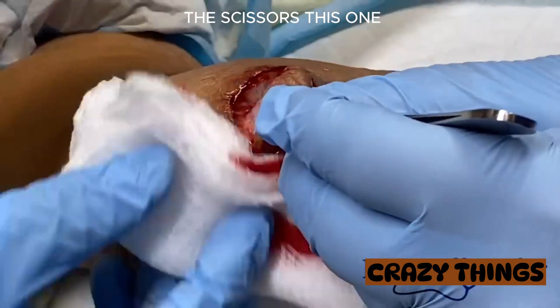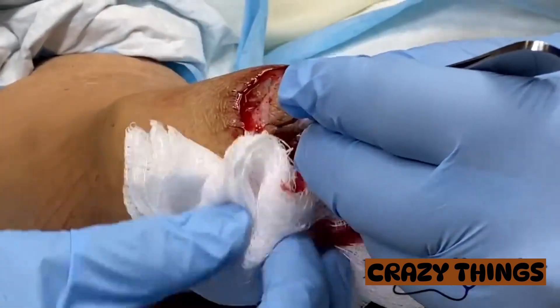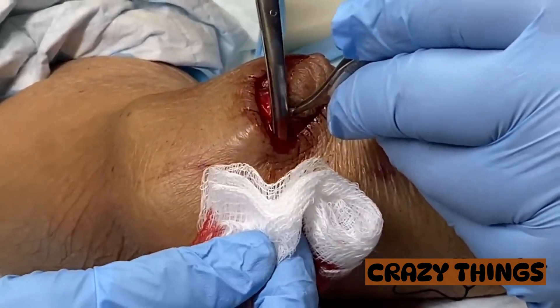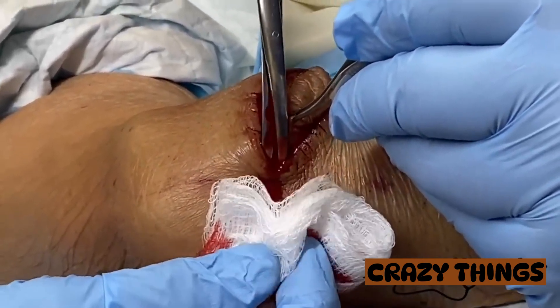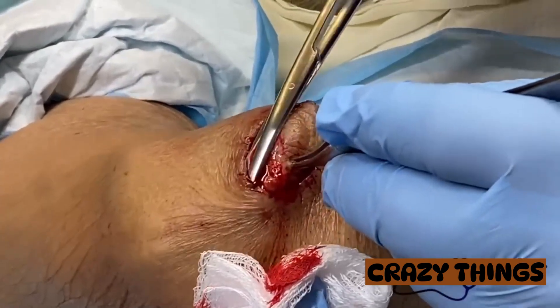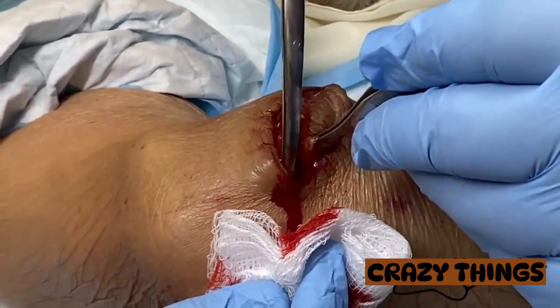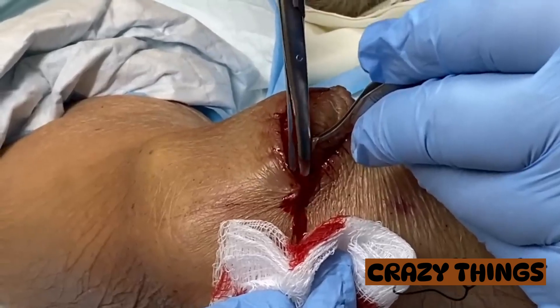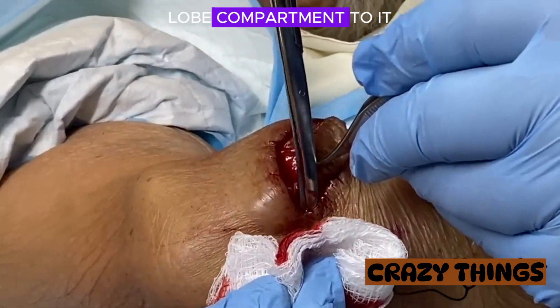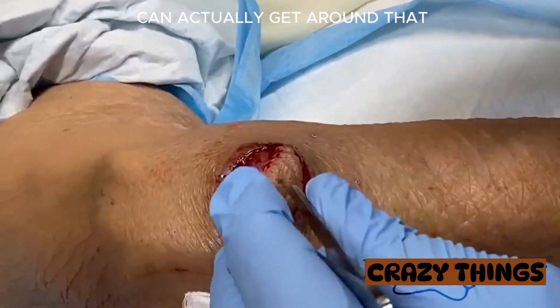Can you grab me the scissors? Is this a big one? So this is the area that felt like there was a bi-lobed compartment to it. I'm just progressing a bit slowly here to see if I can actually get around that.